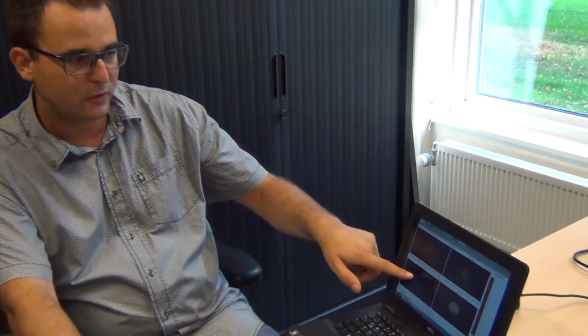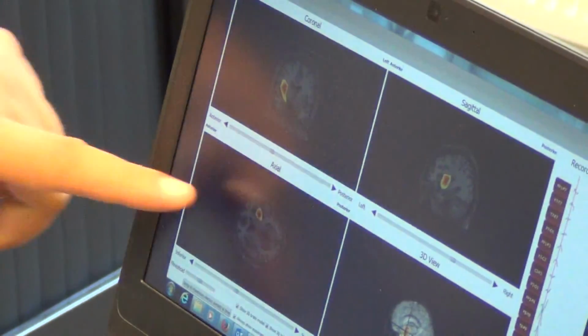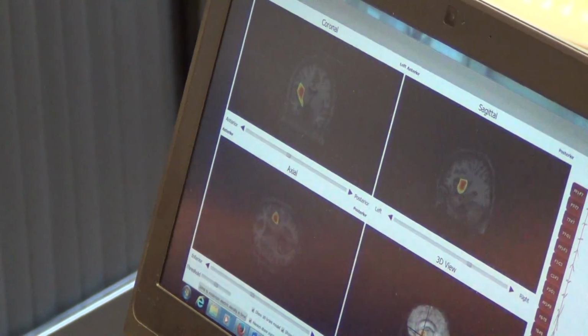Understood. And then at the third step, after having identified and clustered, from the cluster you compute the spatial location, or from the single episode? I mean, the diagram that you showed last, is it about the single episode or the cluster? This one is only for one spike at the moment. I understand. For an average spike we don't have something like that, because the question is, do you average the spike and then perform this, or do you do it the other way around? It's not clear, and we did not get very good results with that. So we did not perform a spatial source localization for the cluster, an average or something like that.